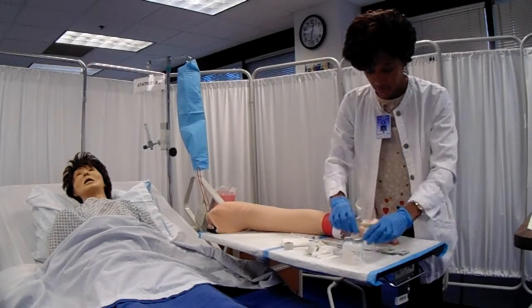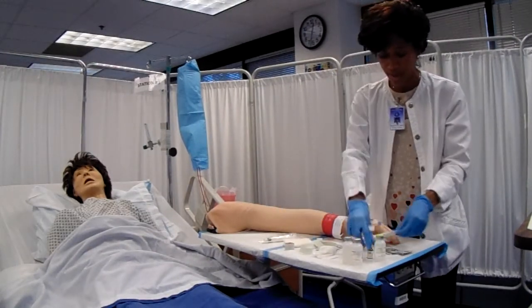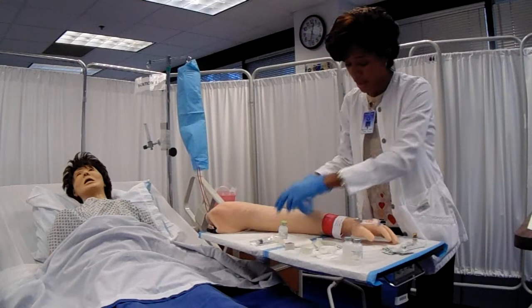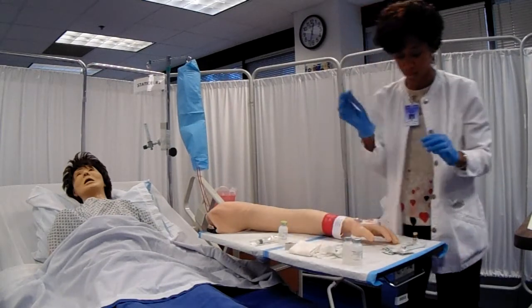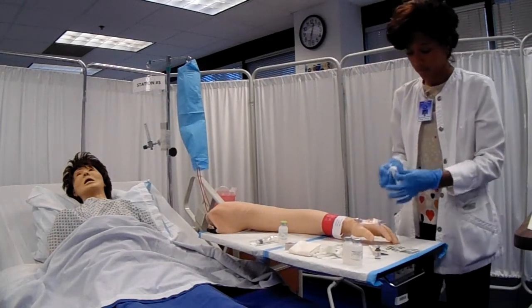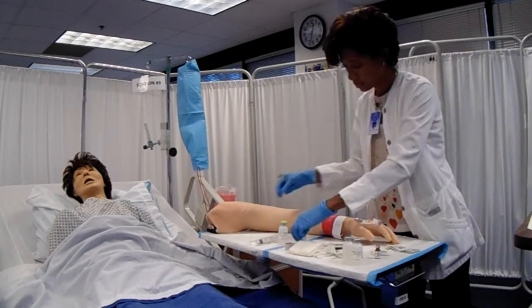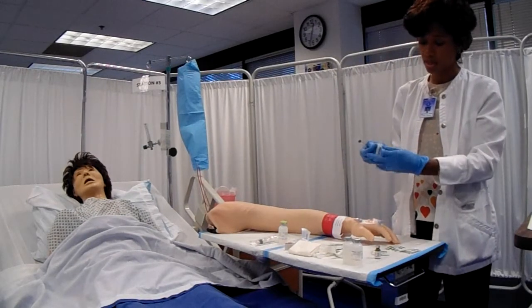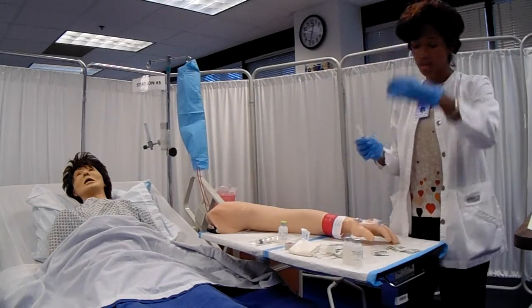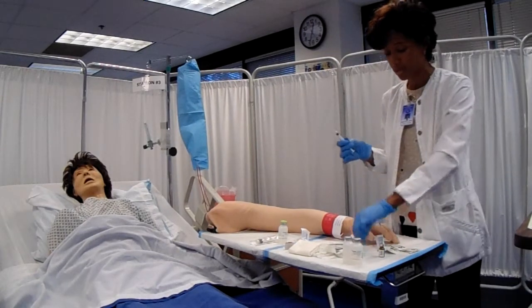Okay, so we've got a nice brand new IV site. I'm going to be using my 3 ml syringe to pull up my furosemide and my 10 ml syringe to pull up my flush. This way I don't get my medication and my flush mixed up. So first let me go ahead and pull up my furosemide. I'm going to use the same technique when connecting my blunt needle, making sure the hub remains sterile. And it's 20 milligrams in 2 mLs, so I'm only going to displace 2 mLs, even though I have a 3 ml syringe.